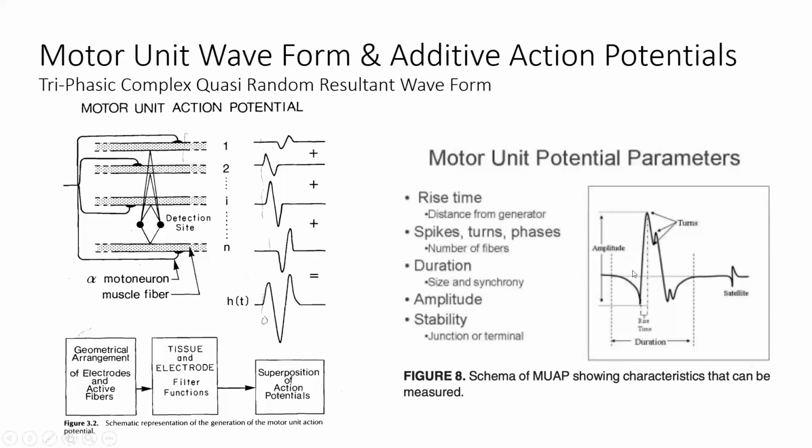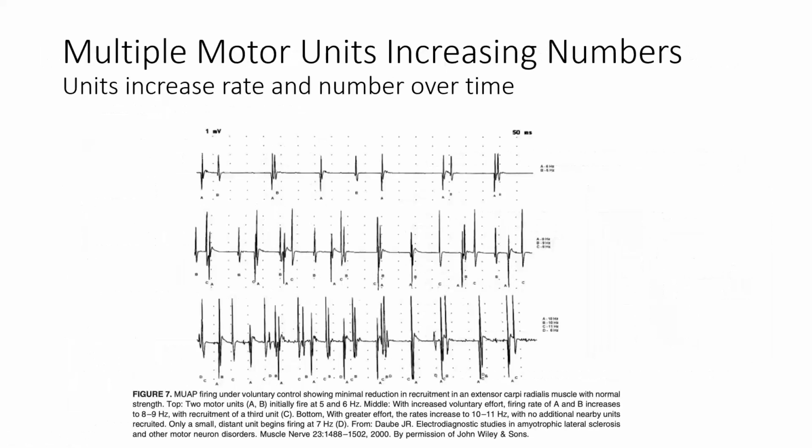And if we can attempt to make it stationary instead of constantly moving, and these waves are not stationary because of their complexity. EEG can be somewhat stationary, but not EMG. We would theoretically get a waveform that looks something like this. And so you can measure amplitude, duration, complexity, and look at it from other angles. That's what they're doing in EMG research now, and they call it a MUAP unit.